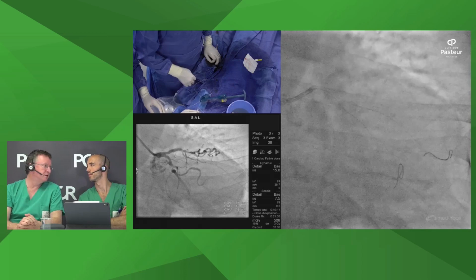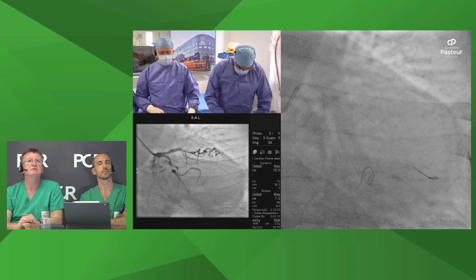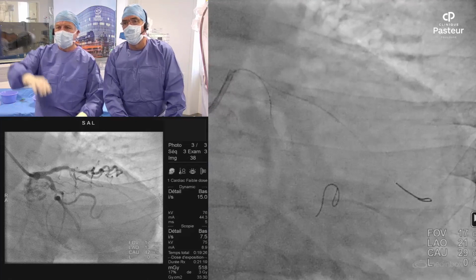I mean, you did incredibly well to get that stent in there, and I think the distal wire position was a big help to you. Okay. Clearly, we are able to straighten a little bit the loop and facilitate. What can we do to take a view, Bruno? It's not too bad here. We have the accordion effect on the distality. But it's okay.